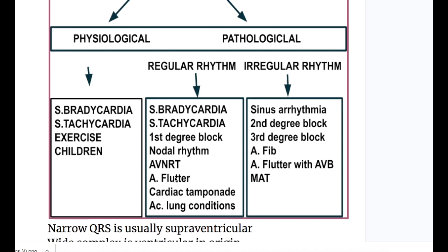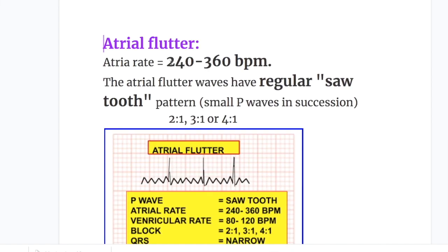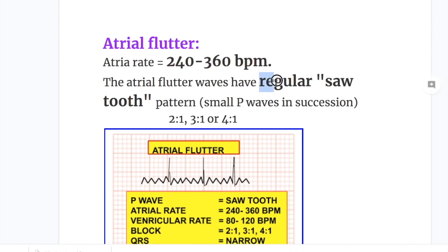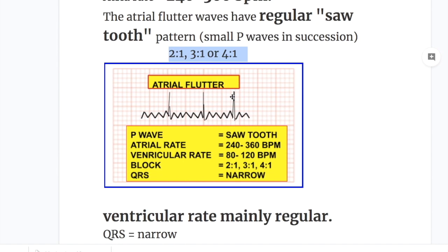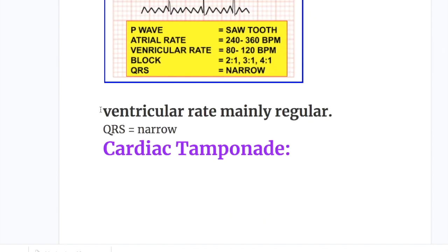Next is atrial flutter. In atrial flutter the atrial rate is 240 to 360 beats per minute. The flutter waves have a regular sawtooth pattern with small P waves in succession. There is a conduction block of 2:1, 3:1, or 4:1, so the ventricular rate is 80 to 120 beats per minute with a narrow QRS. The ventricular rate in atrial flutter is mainly regular.